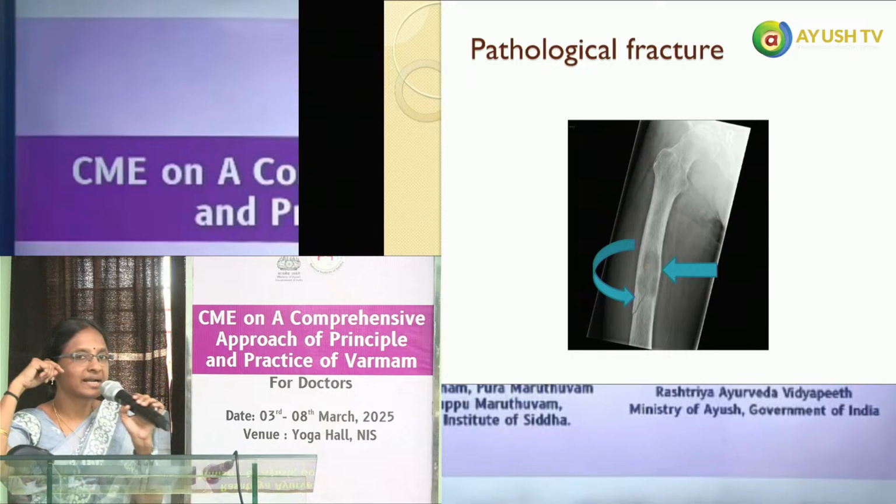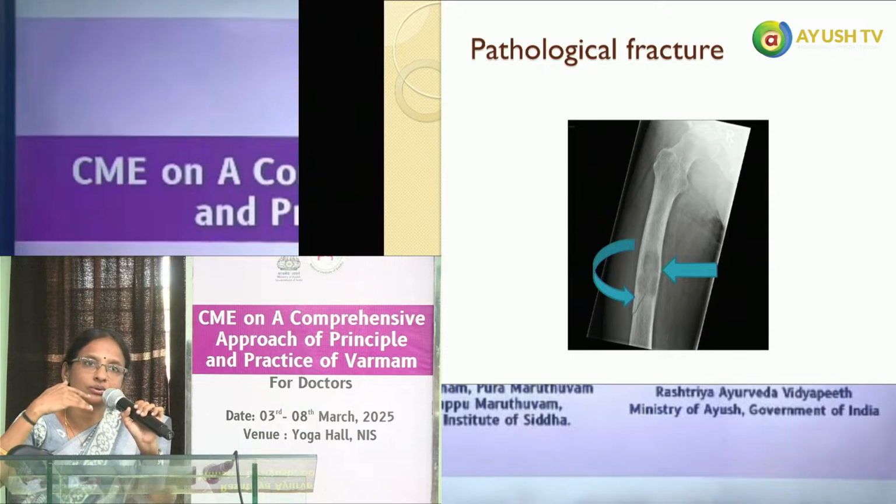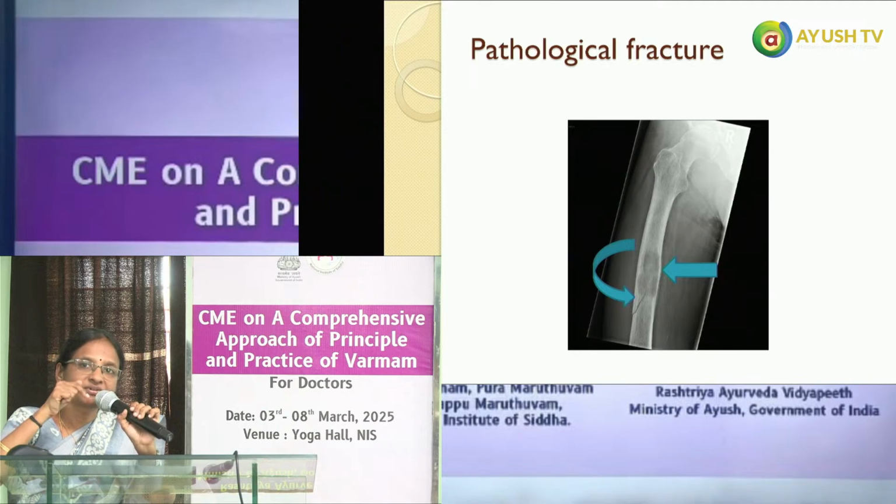See, இது வந்து ஒரு adult X-ray of the thigh, femur bone, pelvis ஓட ஒரு பார்ட்டோட சேர்த்து எடுத்திருக்கு. ஸோ அதில் இந்த ஸ்ட்ரெயிட் ஆரோ பாயிண்ட் பண்ணிட்டு யூஸ்வலி ஒரு போனோட டென்சிட்டி யூனிஃபார்மாக இருக்கணும். ஸோ நடுவில் பார்த்தோம்னா அந்த ப்ளூ ஆரோ பாயிண்ட் பண்ணியிருக்கிற இடத்துல the bone shows some dark area, an irregular dark area seen. That is the tumor part. அது வந்து ஒரு bone tumor. ஸோ அதனால அந்த curved area பாயிண்ட் பண்ணியிருக்கிறது ஒரு சின்ன oblique fracture line is there. So this fracture has happened because of the malignant lesion that is there. And the bone tumor-னால இந்த fracture has occurred. So this kind of a fracture is called pathological fractures.